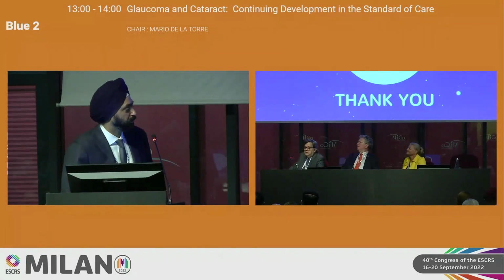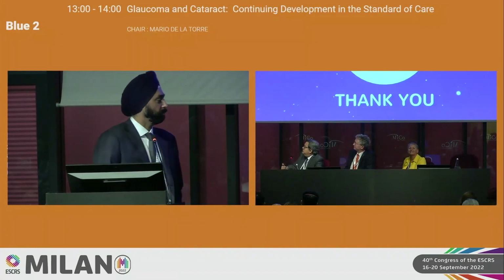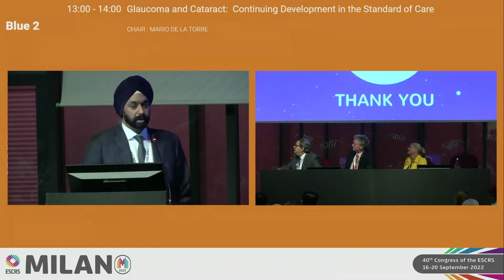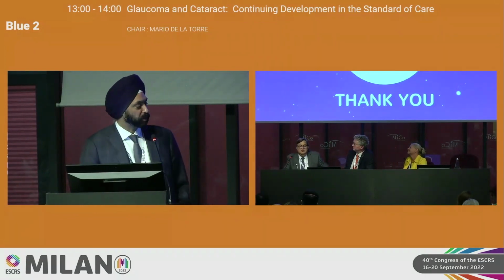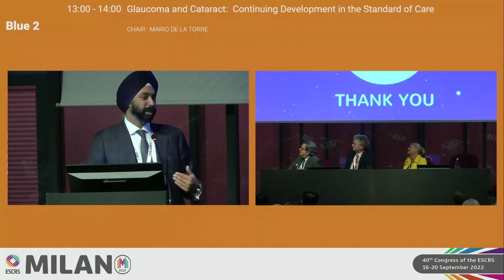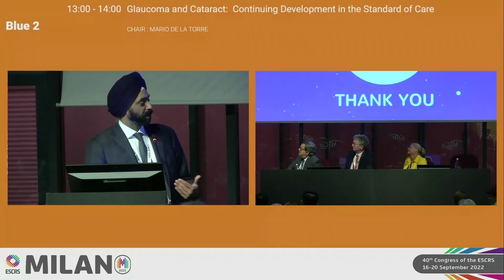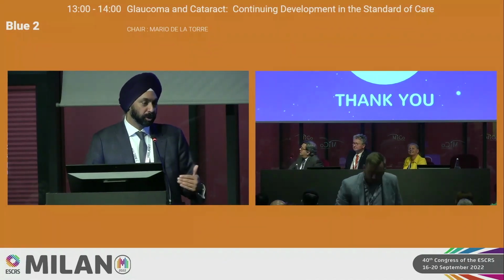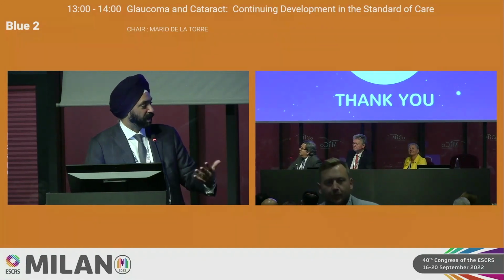What is your schema? You do one session of SLT, and how long do you wait for the results? The full effect can sometimes take 4 to 6 weeks to see. So I don't decide if it worked or not for about 4 to 6 weeks. I'll see them usually about a couple weeks out, and if that looks good, see them about another month later, and then decide.